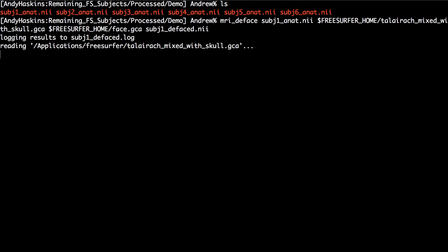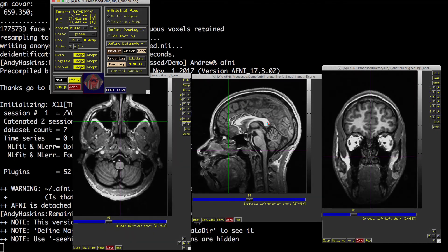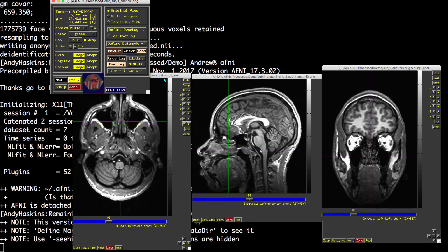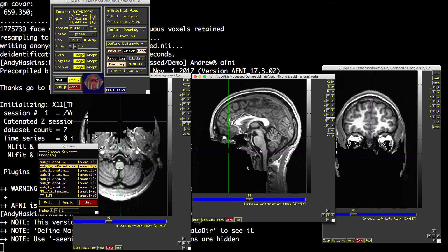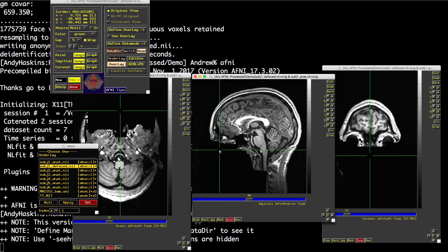On my computer, this takes about two minutes. Once it's done, compare the original and the defaced images in a viewer to make sure it removed the face.